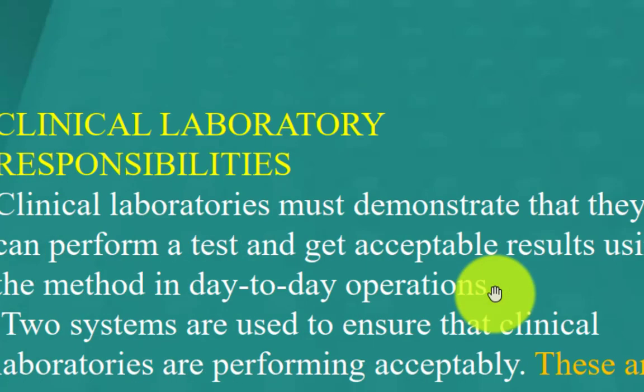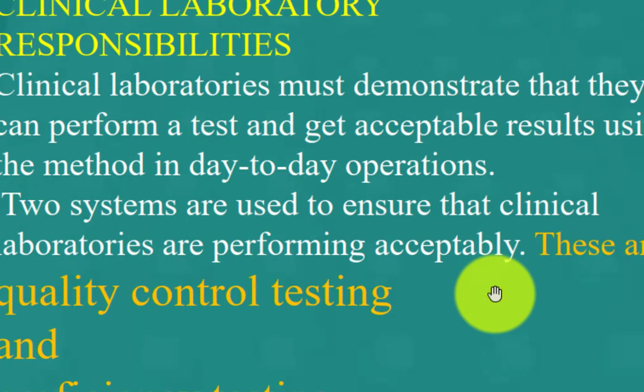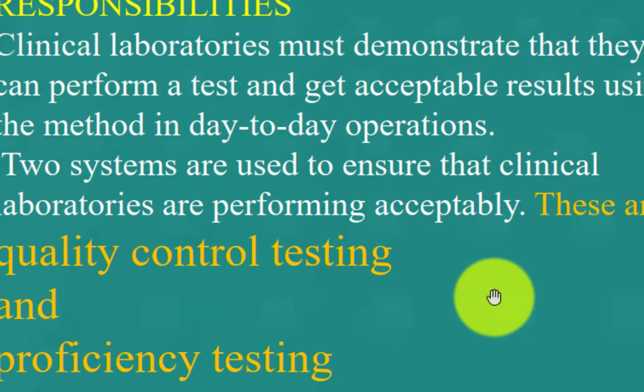Clinical laboratory responsibilities. Clinical laboratories must demonstrate that they can perform a test and get acceptable results using the method in day-to-day operation. Two systems are used to ensure that clinical laboratories are performing acceptably.